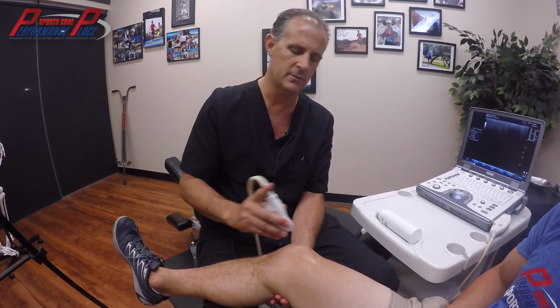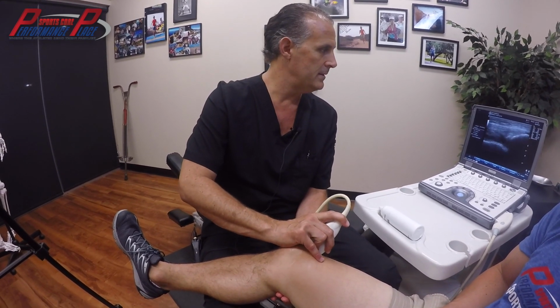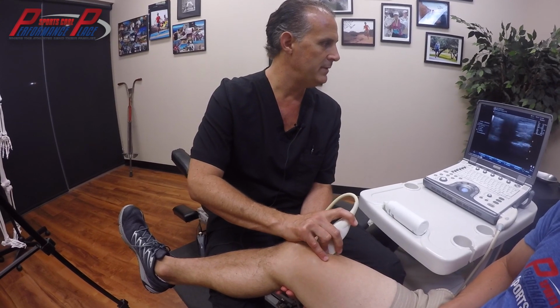And if we're looking face to face with a blown out meniscus, then we need to know that right off the bat. Is this something that needs to go to orthopedic, or is this something that could stay in here and be rehabbed, so we're not wasting time and spinning wheels? Good stuff. Yeah, so that's a little tour around the knee.